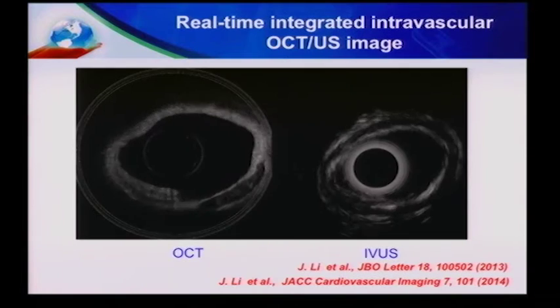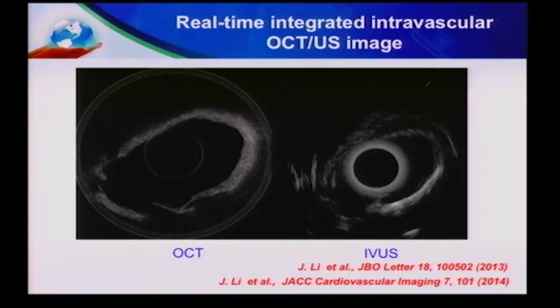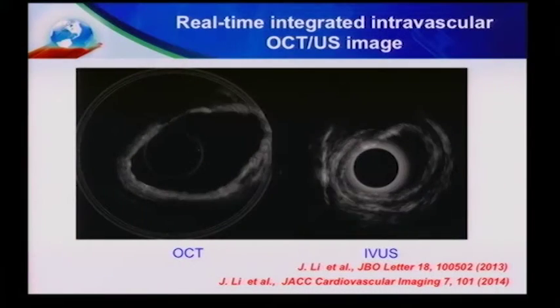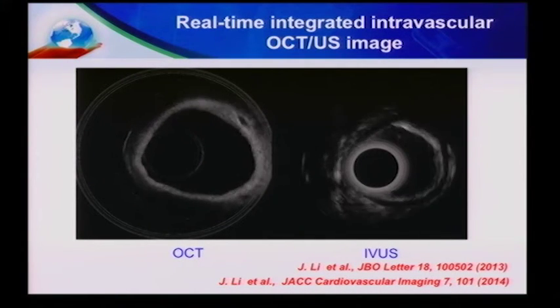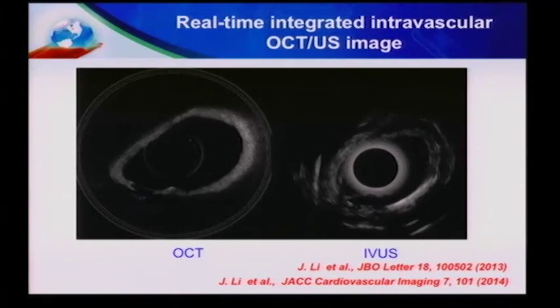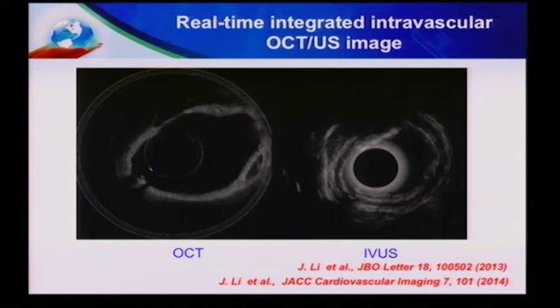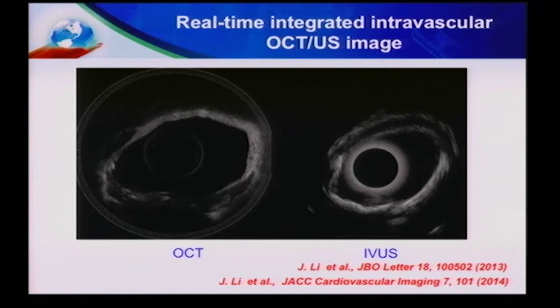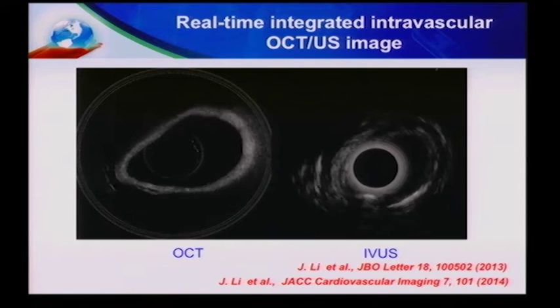We have moved this technology from the benchtop to in vivo study, and this is a look at the pig model. You can see the plaque region when they acquire the image. Essentially this is a pullback, so you get a three-dimensional reconstruction of the whole plaque.